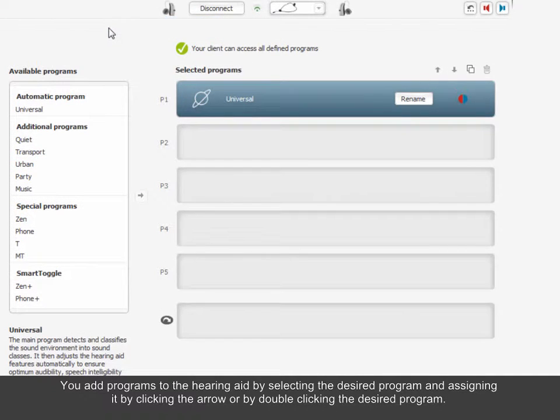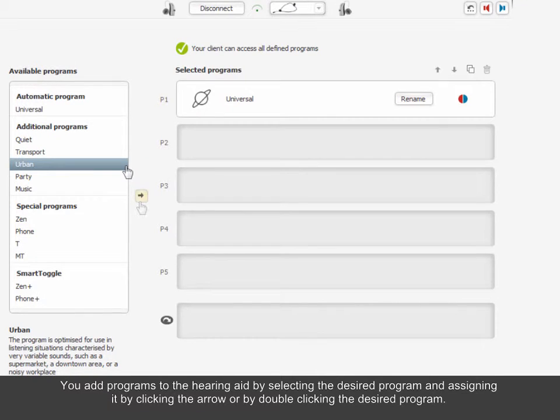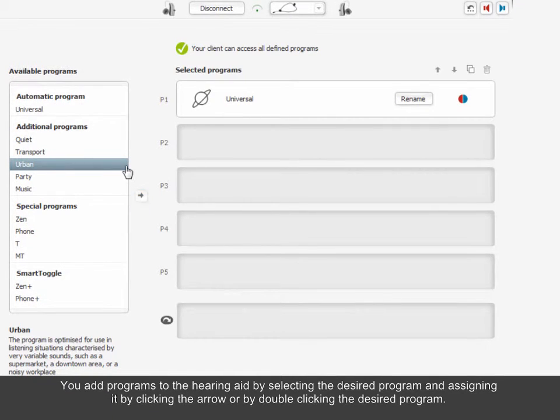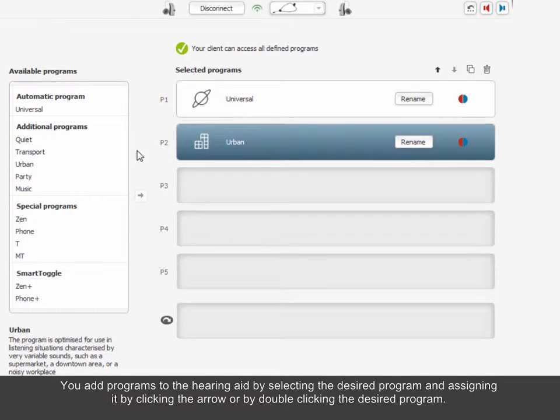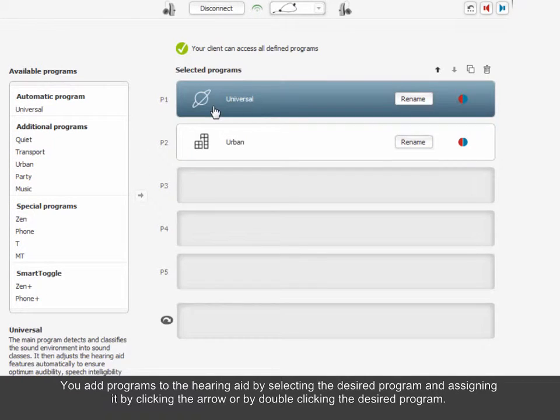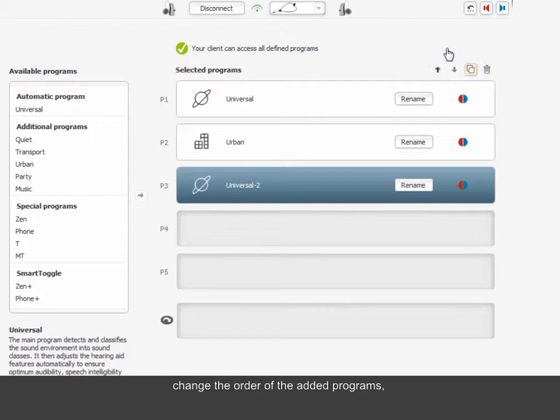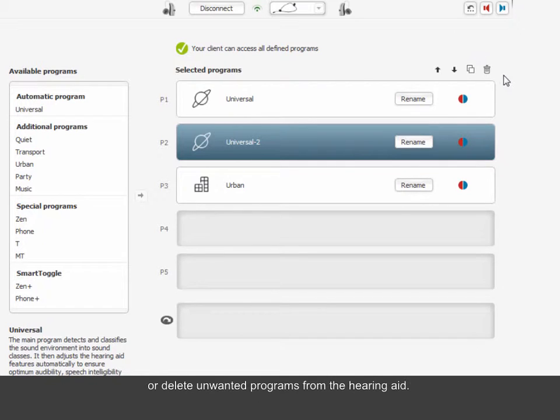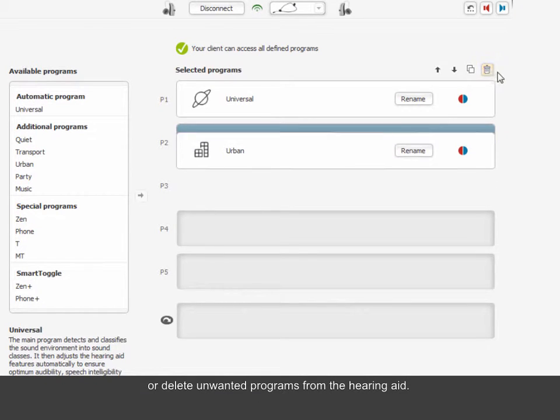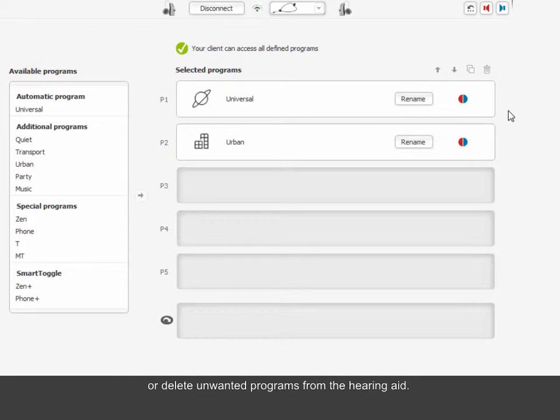You add programs to the hearing aid by selecting the desired program and assigning it by clicking the arrow or by double-clicking the desired program. You can copy a program, change the order of the added programs, or delete unwanted programs from the hearing aid.